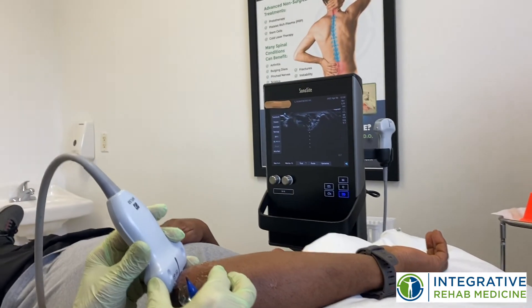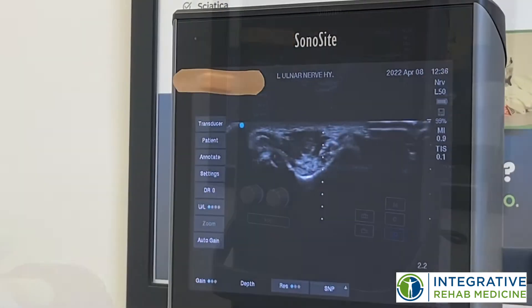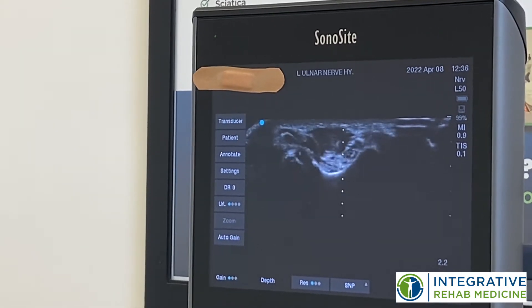So what I'm doing right now, I'm looking at that ulnar nerve and I'm just identifying where it is within the ulnar groove. There's the ulnar nerve right in the middle in the ulnar groove, and that's where we're going to work on decompressing it.